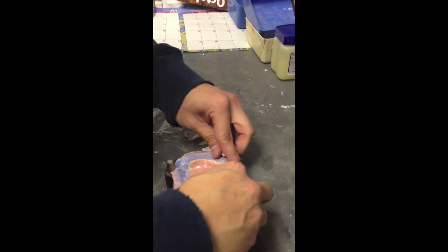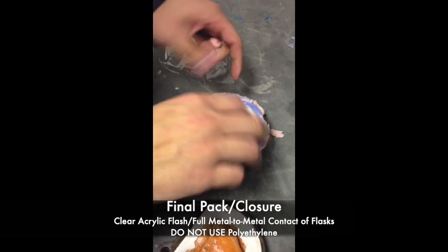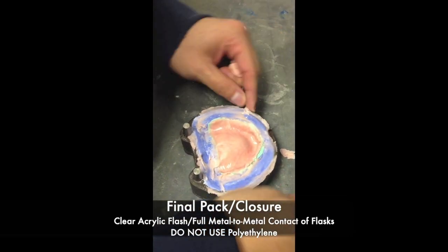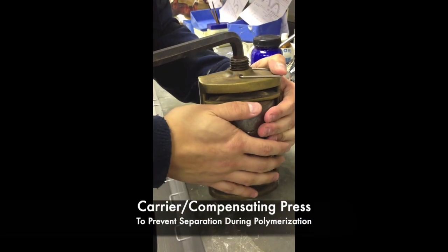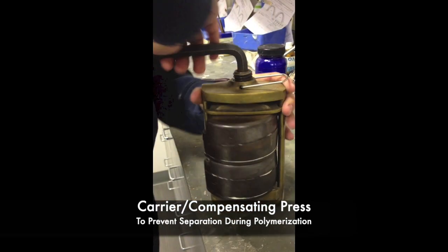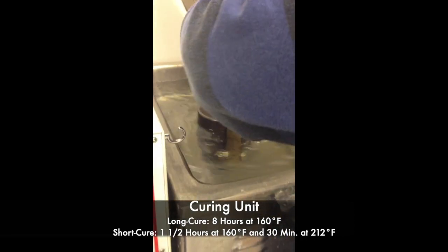After the trial packs are complete, remember to remove the flash and remove the polyethylene sheet. The final closure should have metal to metal contact between flasks. After the final closure, the flask gets put into a compensating press, and the compensating press then gets put into the curing unit, which can be cured in a long cure or short cure method.